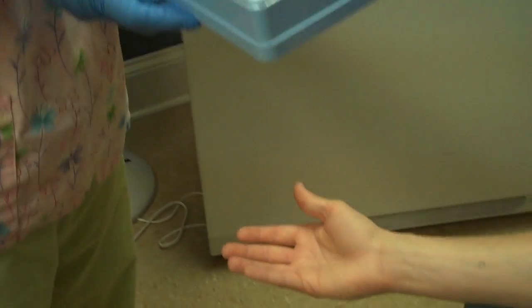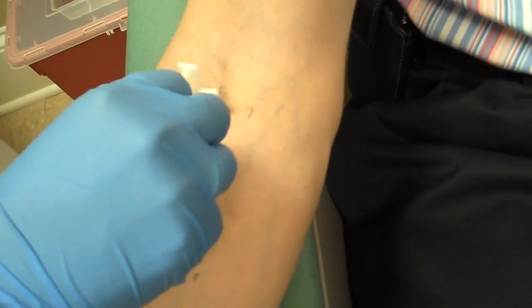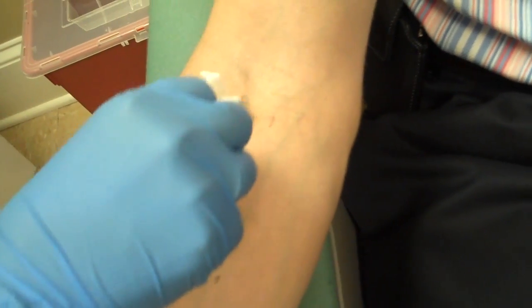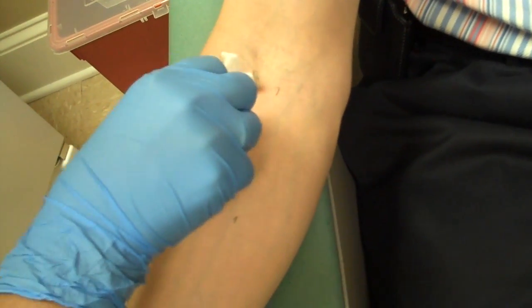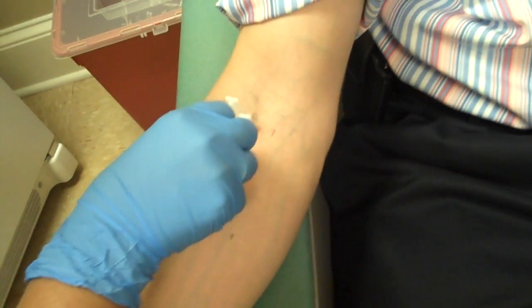The way we're going to test Dr. Coffman is by just applying pressure. We're going to rock it north to south, east to west. We are not breaking the skin, we're not rupturing the skin — just applying light pressure, north to south, east to west. And that is the final product for panel A.